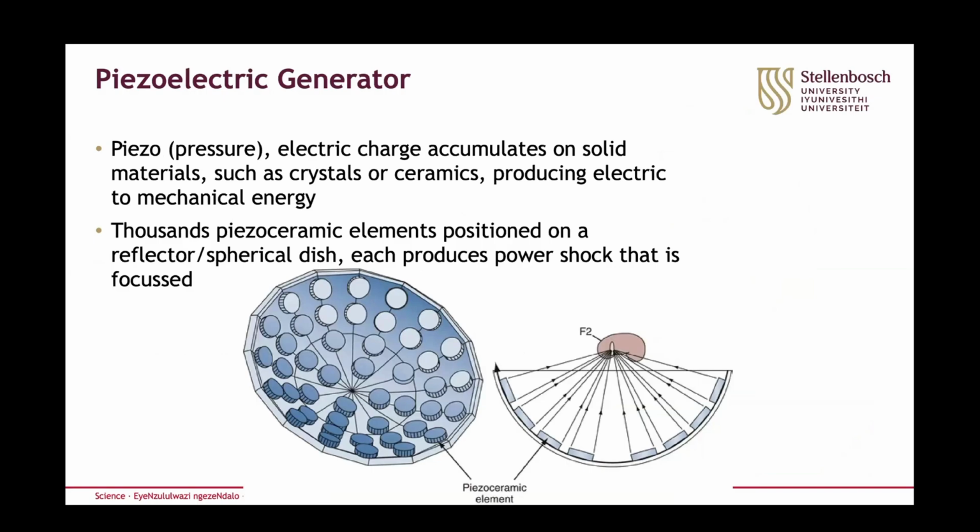Piezoelectric generators, where piezo means pressure, electric charge accumulates on the solid material, such as crystal or ceramics, which produces a mechanical energy. In essence, by applying electricity to either crystal or ceramics, it causes it to vibrate at a certain frequency. Thousands of these piezo ceramic elements are then positioned on a reflector or a spherical dish, each producing a powerful shock that is then focused.